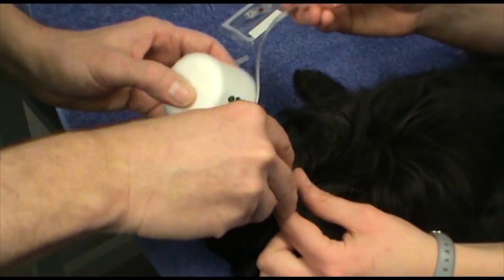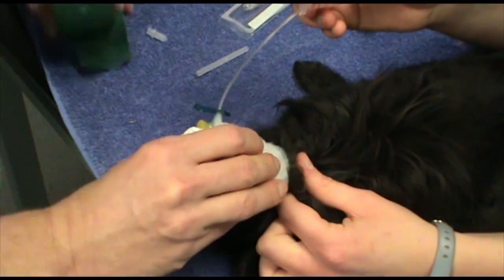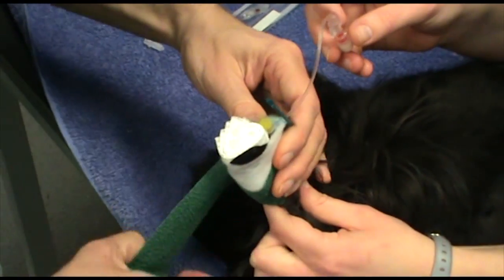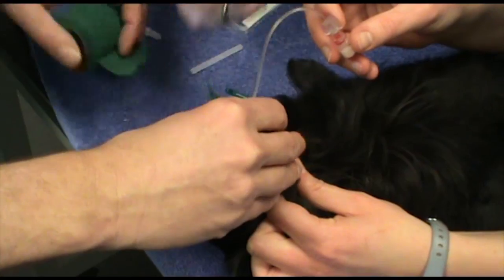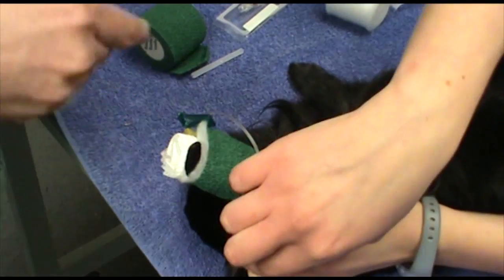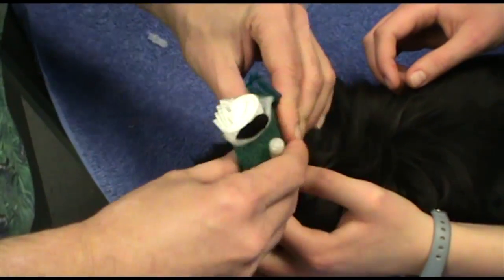You could use a little bit of softpan or a syringe case in there as a bolster. I went through a phase of using syringe cases but they're quite unforgiving, and if you want to keep these in you need the rabbit to be comfortable — a syringe case poking down your ear canal isn't the best way forward. With a swab like this it tends to keep the rabbit happy. We're not so worried about the ear canal with these, but obviously if we're doing ear surgery we catheterise the other ear — remember to think of that in advance.